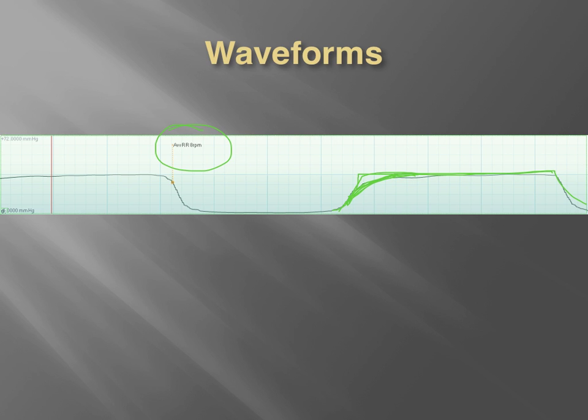Now, being that it's so slight and small and it's towards the top of this waveform, that tells me that it's a later part of exhalation, because if we think about it, this is the part where we start transitioning over from that dead space over to that rich alveolar carbon dioxide in exhalation. So this is coming from the deepest part of the lungs right here. Okay.